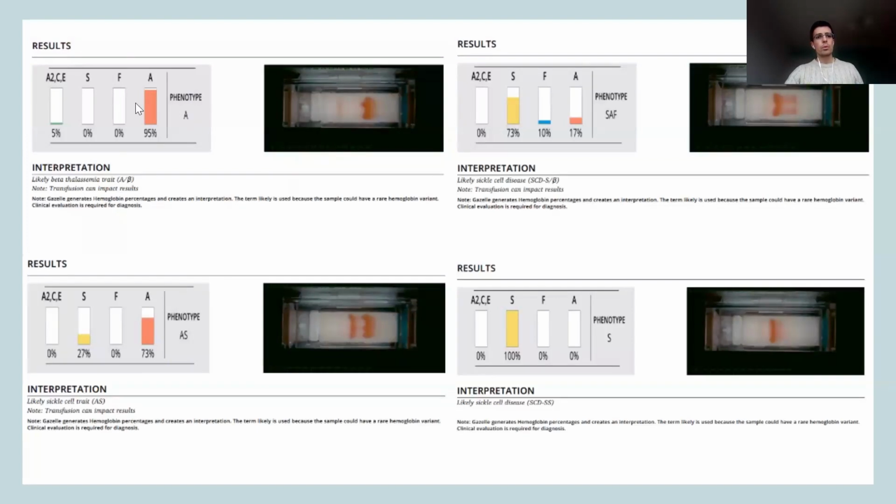Do remember that this is a normal sample that we just ran, and the majority of the hemoglobin was hemoglobin A. Depending on how much A2 it has detected, it gives a provisional or suggested diagnosis, saying it is likely beta thalassemia, but that really depends on other factors which need to be taken into account, like the sample age, which we tested to see how reliable it was within the manufacturer's specifications, and how long the sample will be stable for use with this analyzer.